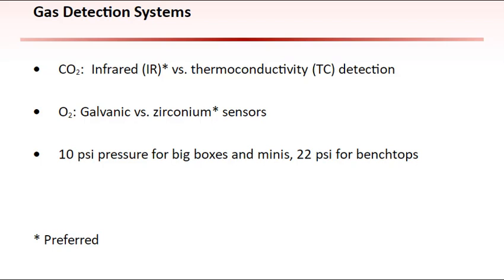complete. A zirconium sensor is an impervious tube with a zirconia element, with a closed end that is coated externally and internally with porous metal electrodes. At elevated temperatures, the element becomes an O2 ion conductor, which results in a voltage being generated between the electrodes. The value of the voltage is dependent upon the differences between the partial pressure of the O2 in the sample and the O2 in a reference gas. Galvanic sensors tend to yield slower response times compared with zirconium sensors and require changing more frequently.